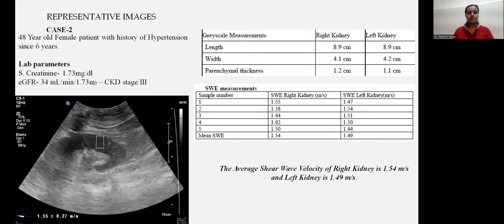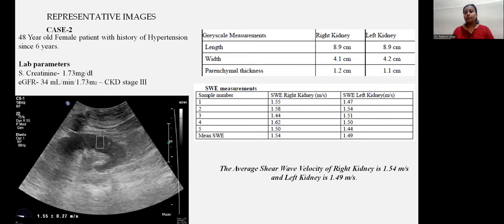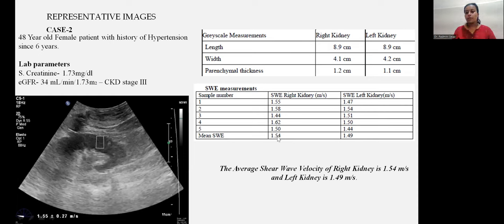Second case: a 48-year-old female with hypertension for 6 years. Serum creatinine 1.73 mg/dL, eGFR 34 ml/min/1.73 m², Stage 3 CKD. Right kidney: length 8.9 cm, width 4.1 cm, parenchymal thickness 1.2 cm. Left kidney: length 8.9 cm, width 4.2 cm, parenchymal thickness 1.1 cm. Average shear wave velocity was 1.54 m/s in the right kidney and 1.49 m/s in the left kidney.